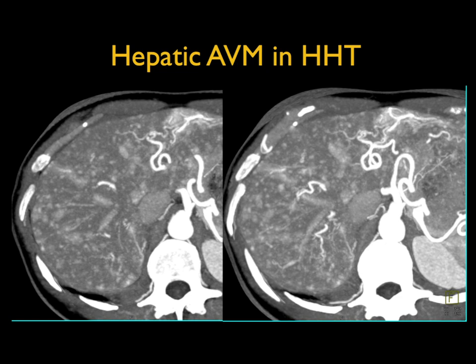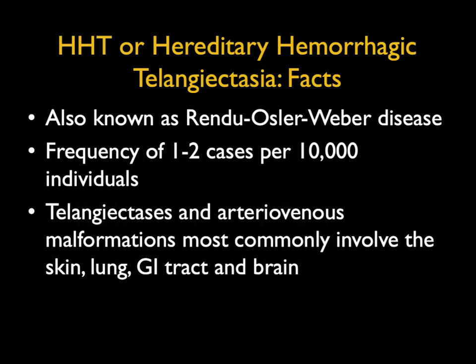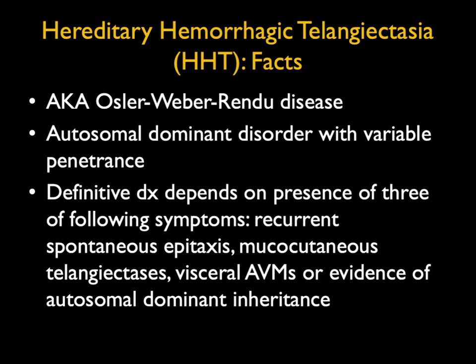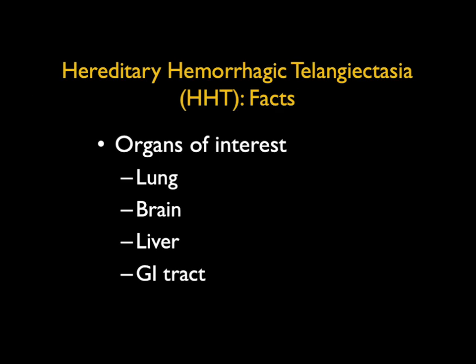One entity that gives you multiple, almost too numerous to count, small aneurysms or telangiectasias — or AVMs — is HHT disease. On arterial phase imaging, you see this incredible appearance of multiple areas of AV shunting and telangiectasias, which quickly become isodense on venous phase imaging. This is also known as hereditary hemorrhagic telangiectasia or Rendu-Osler-Weber disease. These telangiectasias and AVMs can involve the skin, lung, GI tract, and brain. When doing arterial phase imaging looking for PAVMs to embolize, it's not uncommon to see liver involvement. Those lesions becoming isodense on venous phase is very important to recognize.